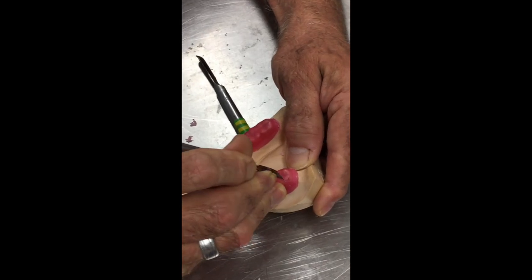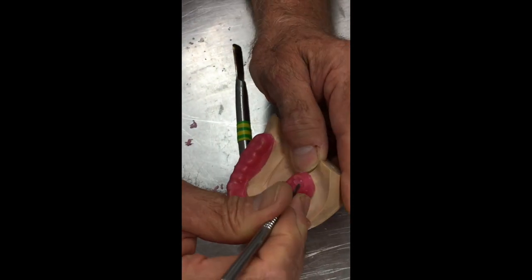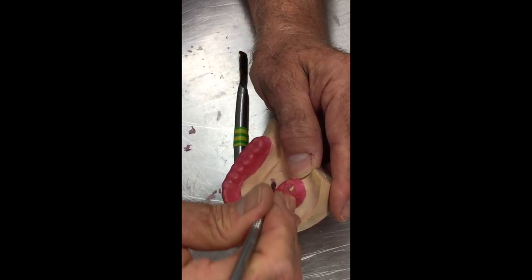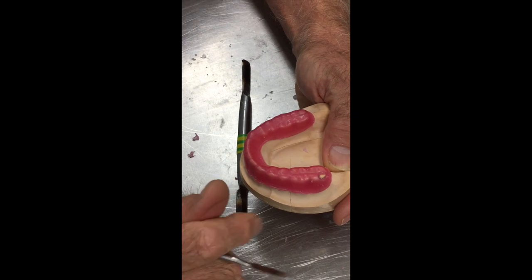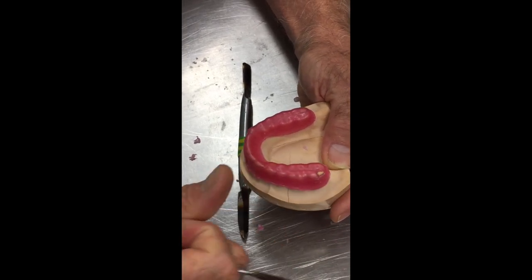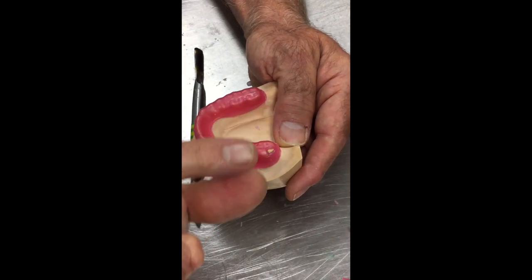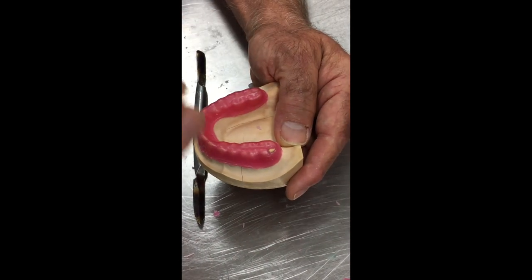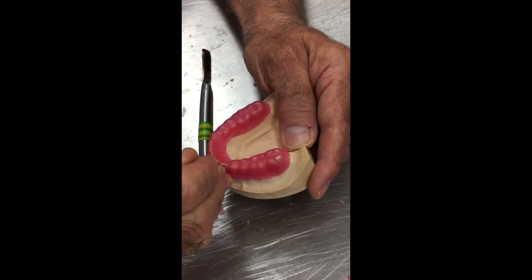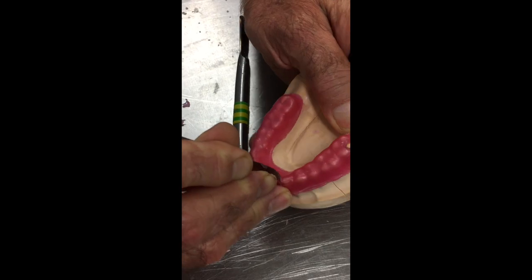And the reason I'm going to do that is so that, if you can picture, the impression material is going to be just like this wax. It's going to come up and then finish hard against the edge of that vertical surface. So we have impression material that's meeting the tissue stop in a strong sense. It's not tapering off into a fine edge that's likely to lift. So we get nice, strong material right up to these tissue stops.